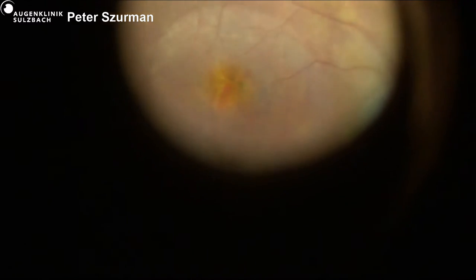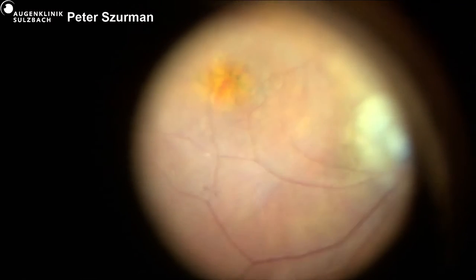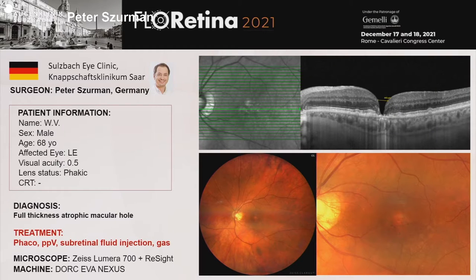We saw the preoperative OCT with the barrel-like configuration of the hole with strong adherence. Yes, good to show it again. There obviously, Peter, there is no traction. Is it really necessary to remove the ILM in these cases or in this situation?